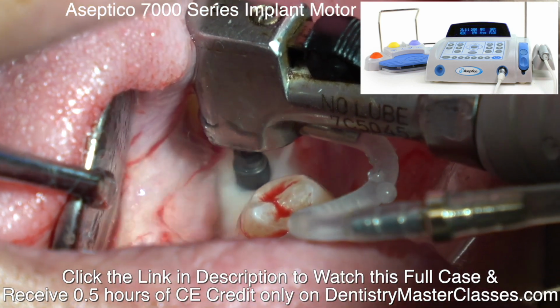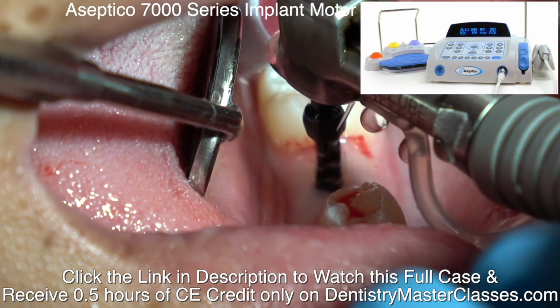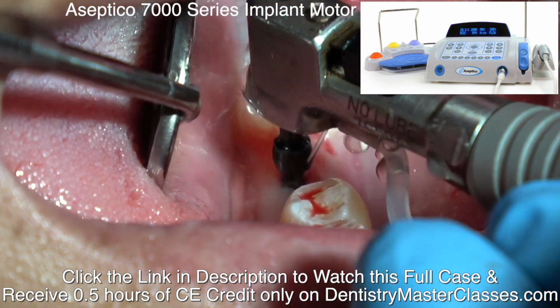So here we go. This is the 2.2. Then I'm going to go to 2.8, and I'll usually take a radiograph either every drill or every 2 drills.